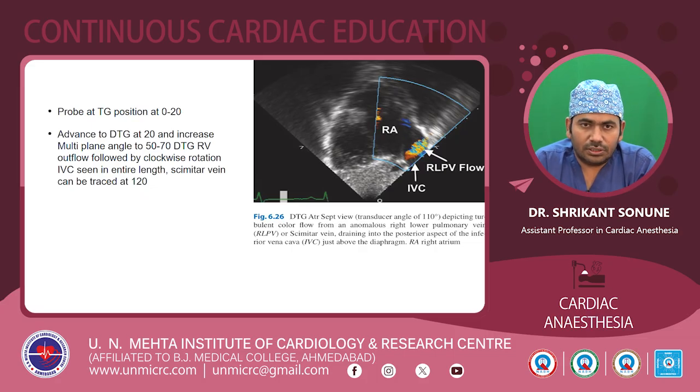This view is suggestive of an abnormal scimitar vein, which can be traced at this angle of around 110 degrees.